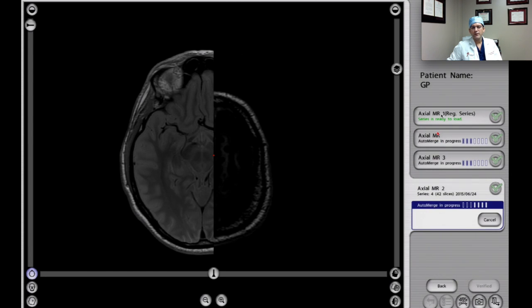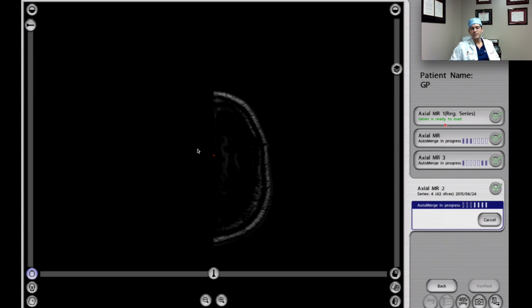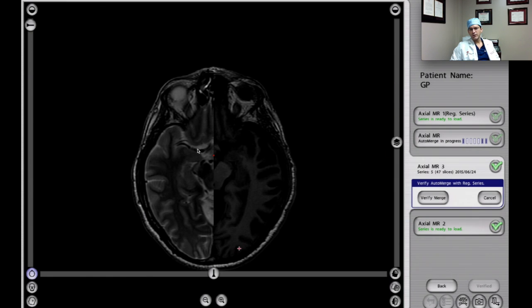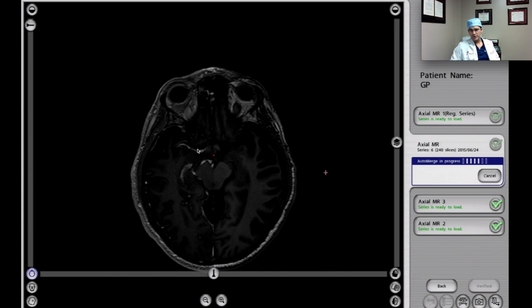You can see here I have four different MRI sequences done on a GE scanner. There's an SPGR, which is a T1 high-resolution three-dimensional study, both with and without contrast, a proton density, and a T2 FSE. All my DBS patients undergo these four sequences. The SPGR with contrast is so I can see blood vessels. The main SPGR is our core three-dimensional study. T2 FSE is good for visualizing the subthalamic nucleus, and proton density is to see the internal capsule, primarily for the globus pallidus.